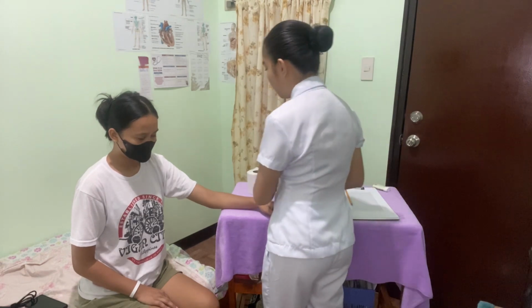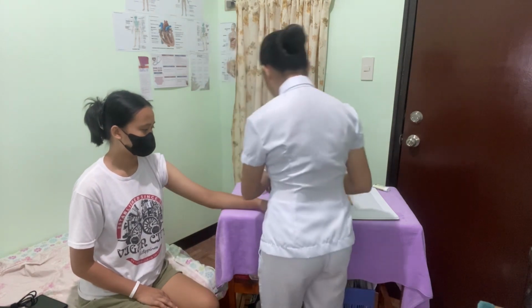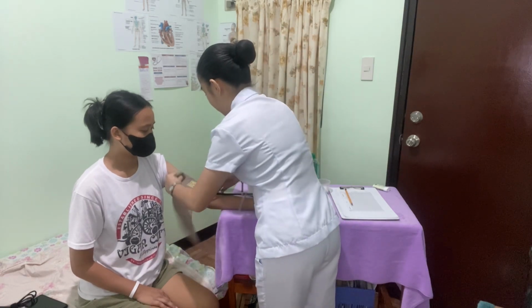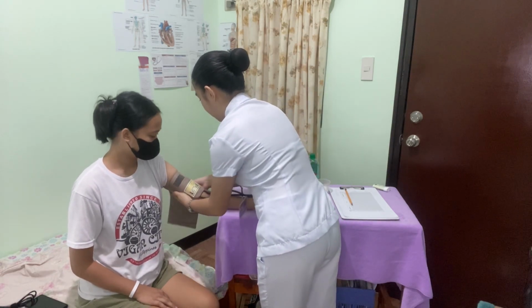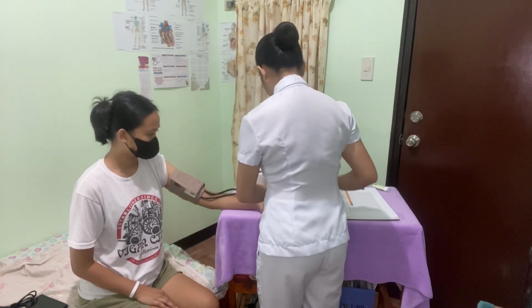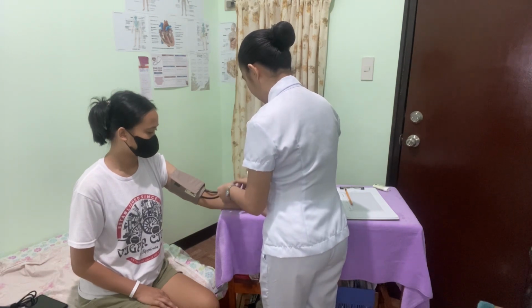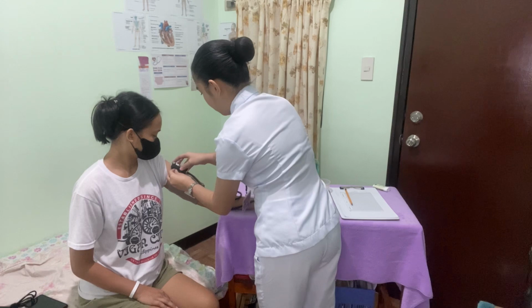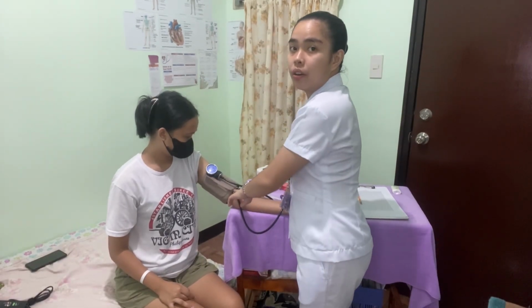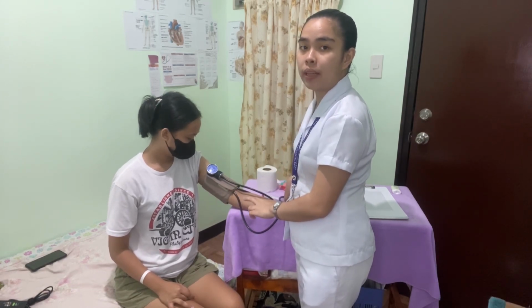So, ma'am, can I pull up your sleeve? So now I'm gonna put this cuff on your arm. Okay, just about 1 to 2 centimeters above the antecubital space.